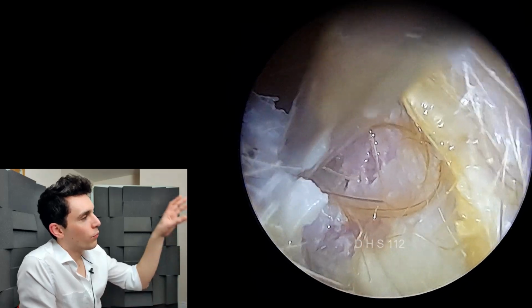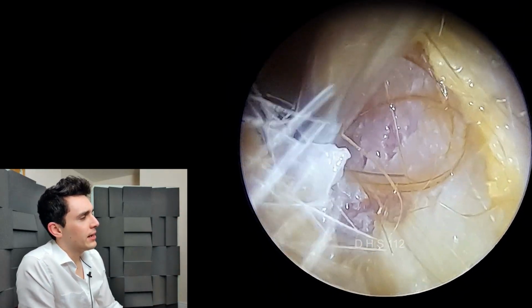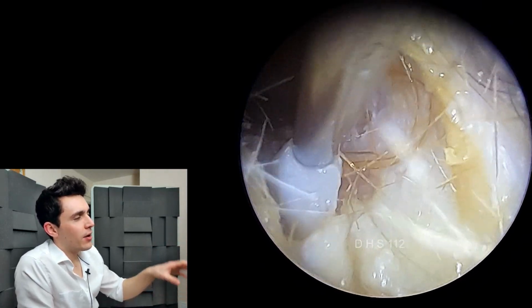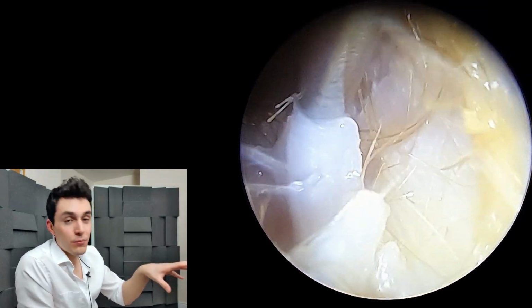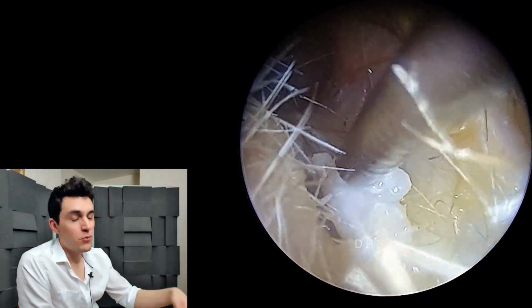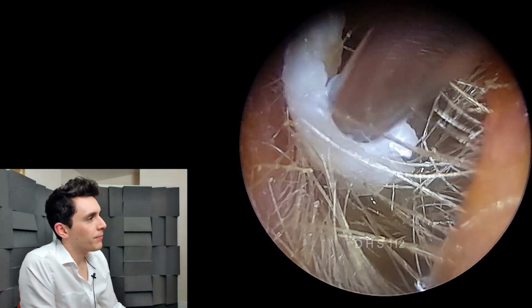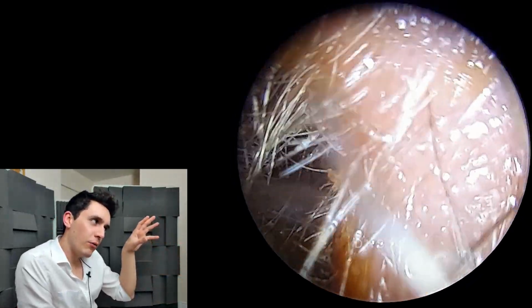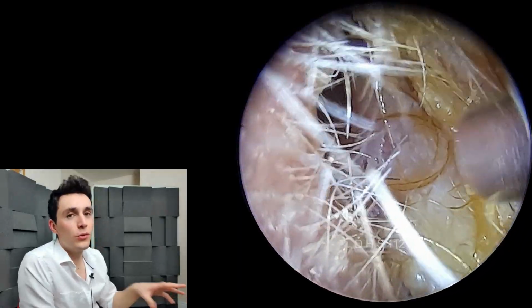So what I'm doing here, and you can see this sheet of pale dead skin here, is I'm stripping everything away. Now, normally I wouldn't put in quite as much effort as I'm putting in right now. If you look at the other cases I've shown before, I suction away most of the stuff, but there's usually a lot of debris left behind. But in this case, I want to put in just a little bit more effort because I can almost guarantee that if this infection reoccurs, this patient will not go to the doctor.